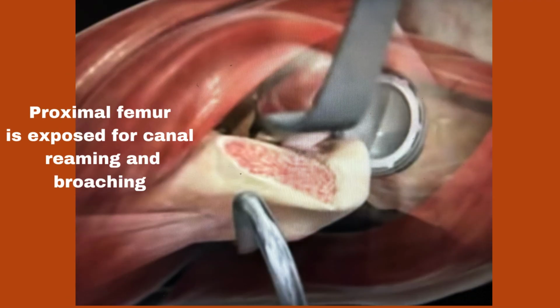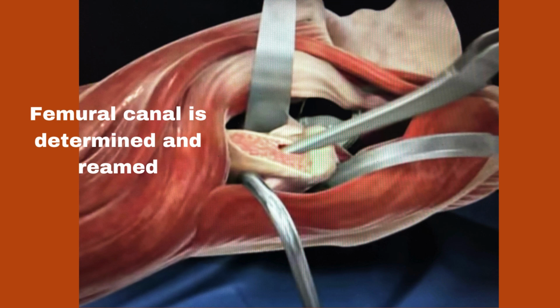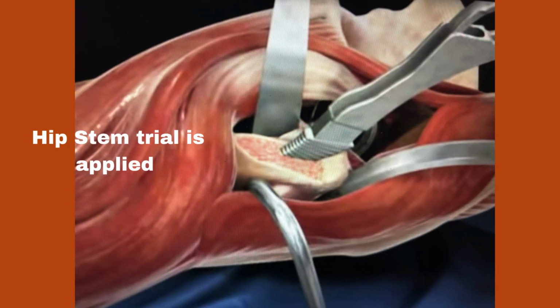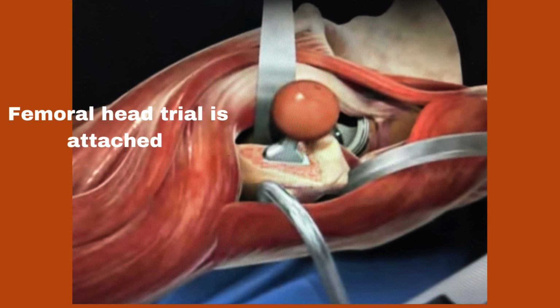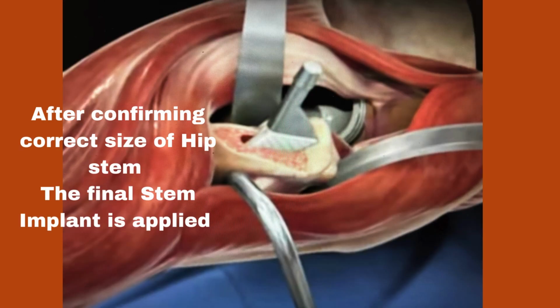The surgeon prepares the femur bone by broaching and inserts the prosthetic femoral stem into it. The femoral stem is a narrow, tapered metal shaft that fits several inches down inside the femur. The top of the stem is designed to hold a prosthetic ball that will replace the femoral head. Then the surgeon will remove the trial components.